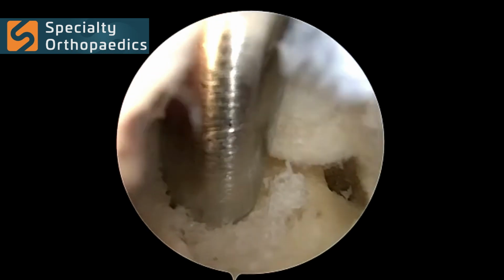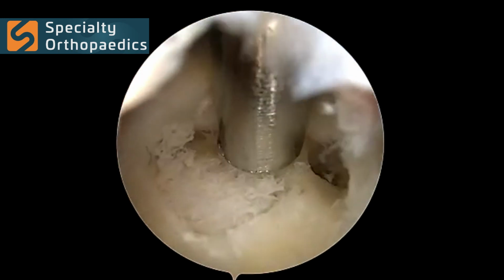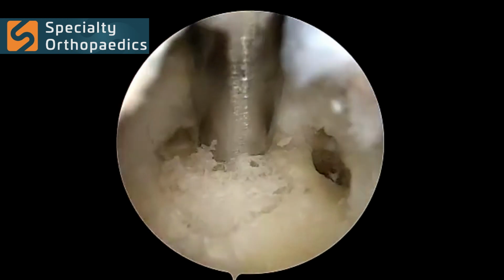An anchor of choice can then be inserted adjacent to the lesion within solid bone to allow for stable fixation of the anchor. Anatomic rotator cuff repair is then carried out in a standard fashion.